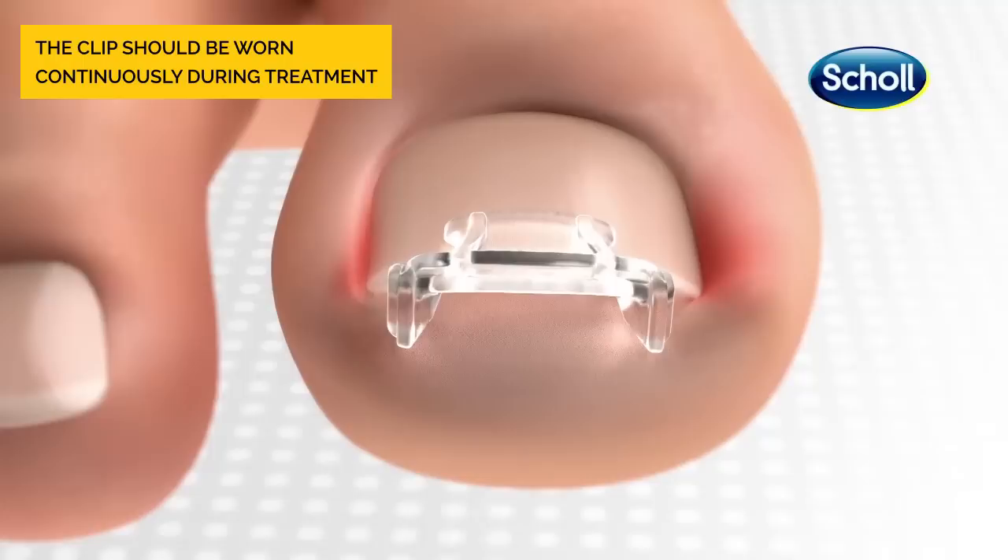The clip encourages the outer edges of the nail upward, lifting the edges away from the skin.